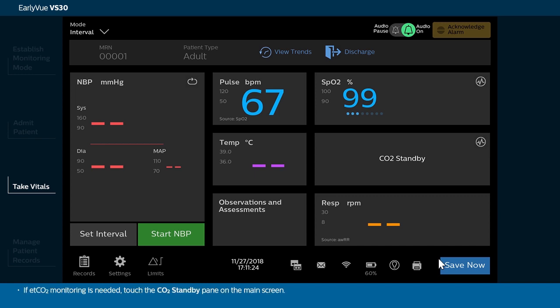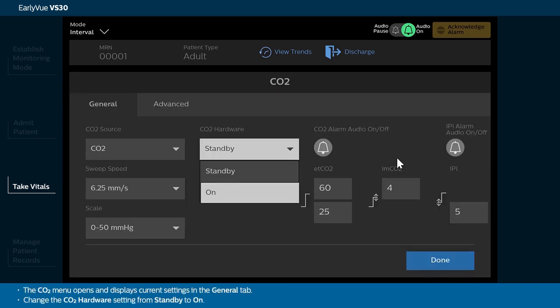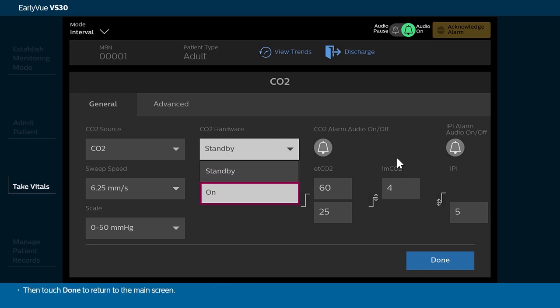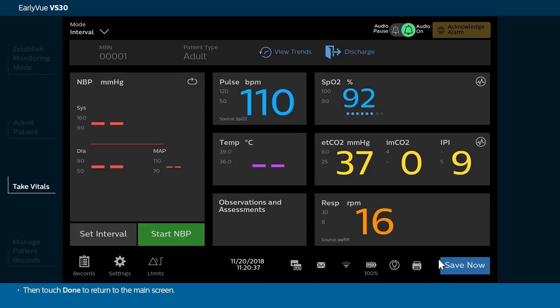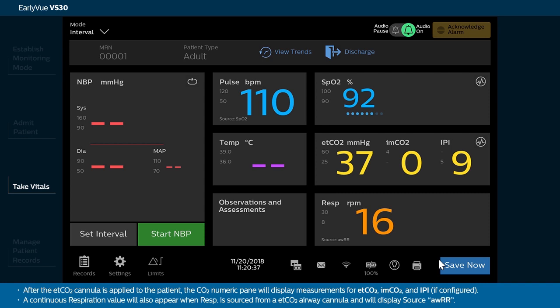If ETCO2 monitoring is needed, touch the CO2 standby pane on the main screen. The CO2 menu opens and displays current settings in the General tab. Change the CO2 hardware setting from standby to on, then touch Done to return to the main screen. After the ETCO2 cannula is applied to the patient, the CO2 numeric pane will display measurements for ETCO2, IMCO2, and IPI if configured. A continuous respiration value will also appear when RESP is sourced from an ETCO2 airway cannula and will display source AWRR.